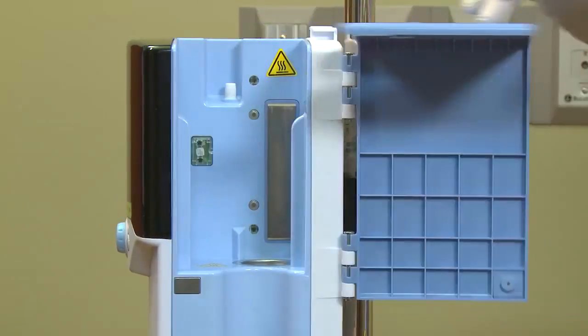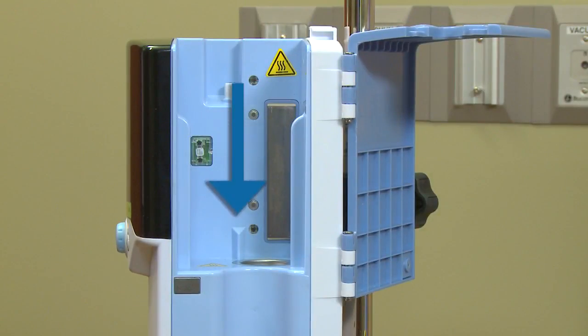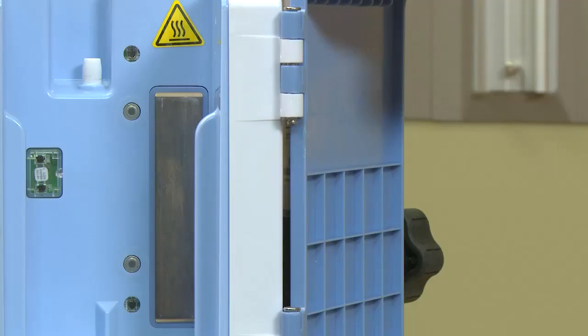With the unit door open, note where the disposable patient circuit — also referred to as the DPC — will be placed. Within the docking area are the heating plate and other optical sensor ports. The sensors monitor what type of DPC is installed — low flow or high flow — and lock in the flow range depending on the type of DPC. They also monitor water temperature, water level, and water circulation. Inspect sensors to ensure they are clear, and wipe with a 70-90% alcohol wipe if cloudy.